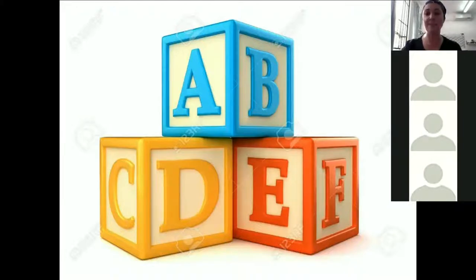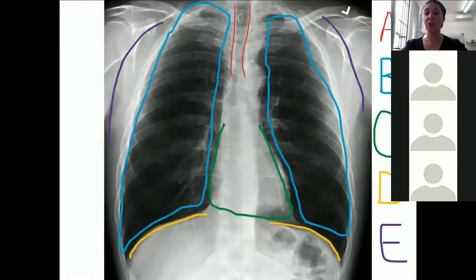Okay, so back to having a quick look at what you're looking at on your chest x-ray, using an ABCDE approach. In terms of basics, what you're looking at initially is airway, and you want to have a look at your trachea. Is your trachea central or not? Next thing you want to have a look at is whether or not your lung fields are nice and clear. So you want to look at B for breathing and have a look at the lungs.